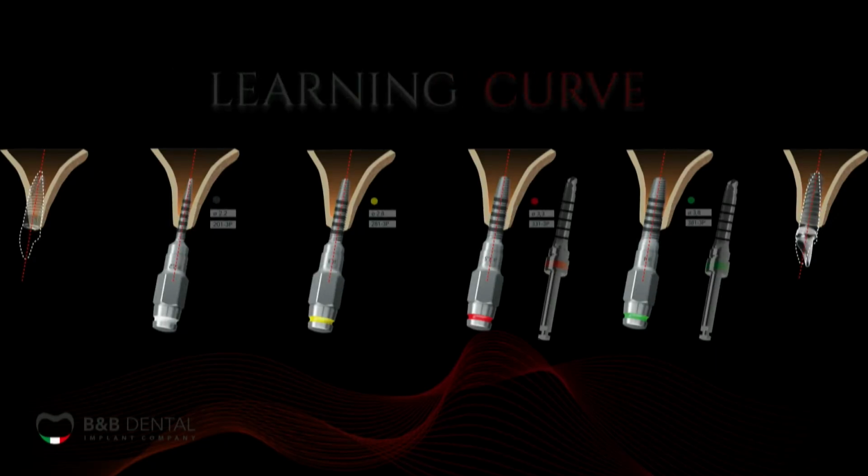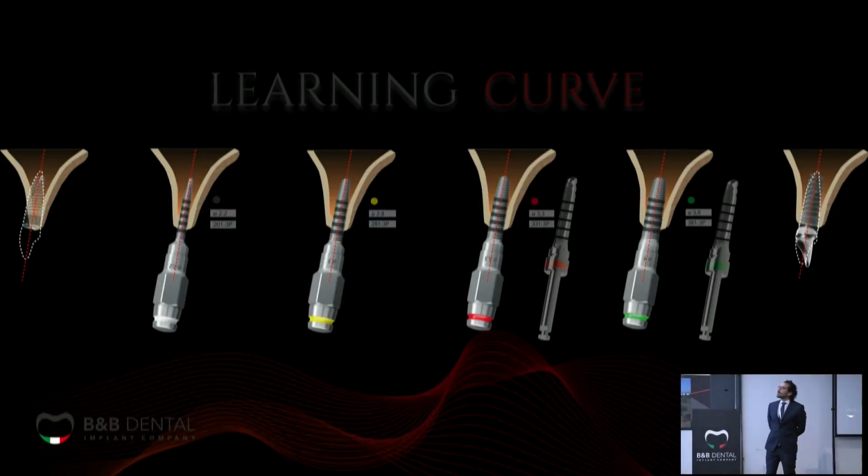Of course, we have a learning curve in these manual techniques. We need to develop our hand feeling to listen to the bone, like Marco used yesterday. And this is very important, but I have to tell you that when we use the screw expanders, the technique is going to be easier and easier and predictable in time.